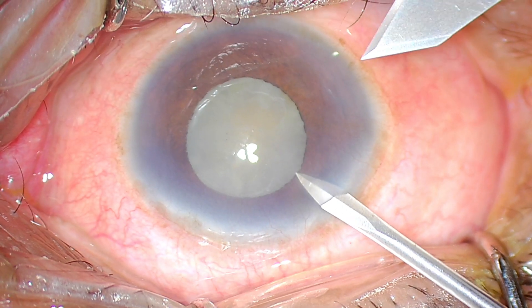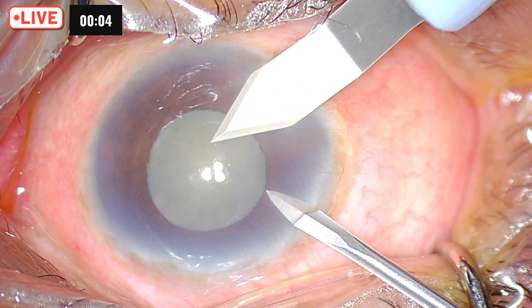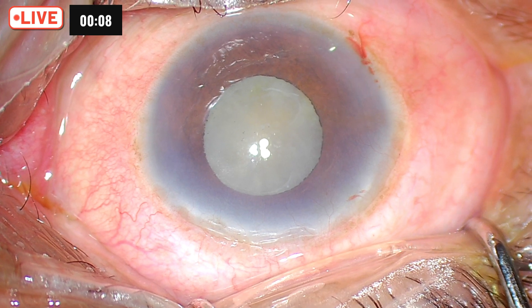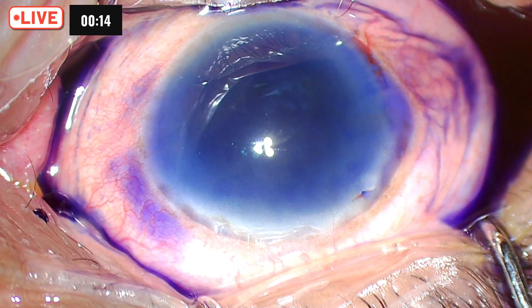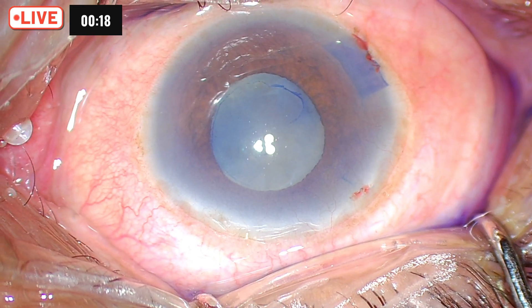This is a case of hypermature cataract, pseudo exfoliation, posterior synechiae, and probably an intumescent cataract. It is a non-dilating pupil. We wanted to go ahead by putting a B-hex pupil expander, sphincterotomy, pupiloplasty, and all those things put together.